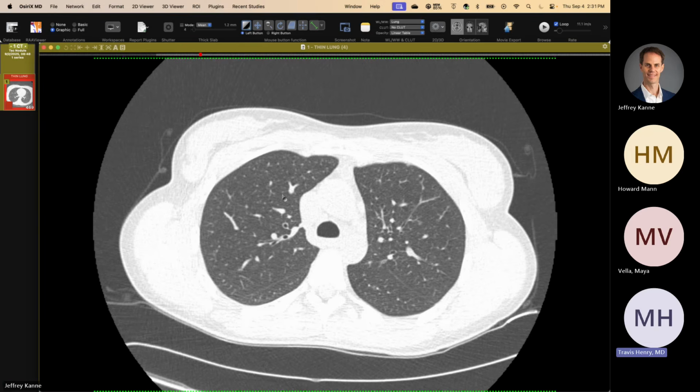So I remember the first case of MMPH I saw as a fellow was a male patient they were following that had a bunch of ground glass nodules in the setting of tuberous sclerosis. But that paper from radiology that talks about the bone islands or the sclerotic bone lesions differentiating tuberous sclerosis from sporadic LAM is really helpful for cases like this. Yeah, exactly. I also think the fat deposits in the myocardium are probably, I've never seen one that was not in TSC LAM. So I tried to look that up and haven't found anything about that in the literature.